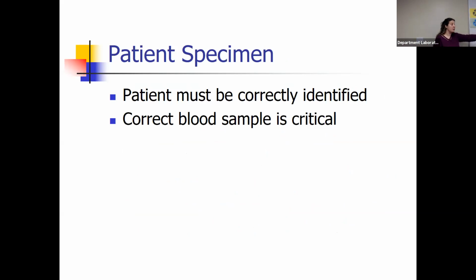And so they're still in the UAMS system as Baby Smith, but in the blood bank system they have a different name, all right? So during the admission process, UAMS updated their information, but remember at UAMS, our blood bank system and the EMR do not communicate, right? So in that instance, we have to go into their file, look at their driver's license, look at their date of birth, and we have to prove that it is the same patient, okay?